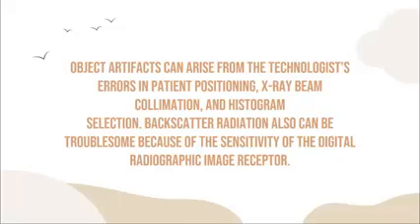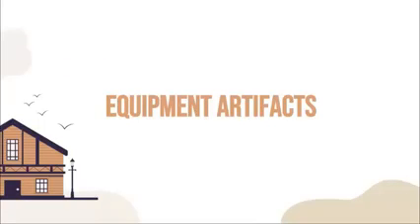So in the production of imaging plates and also kanang image receptor or the cassette, dapat ang likod jud ana niya is increase ang atomic number so that it can shield the backside of the cassette from backscatter radiation, thereby not affecting the film inside or the imaging plate inside the cassette. Okay? All artifacts caused by equipment will fall on this category. Of course, equipment artifacts yan.